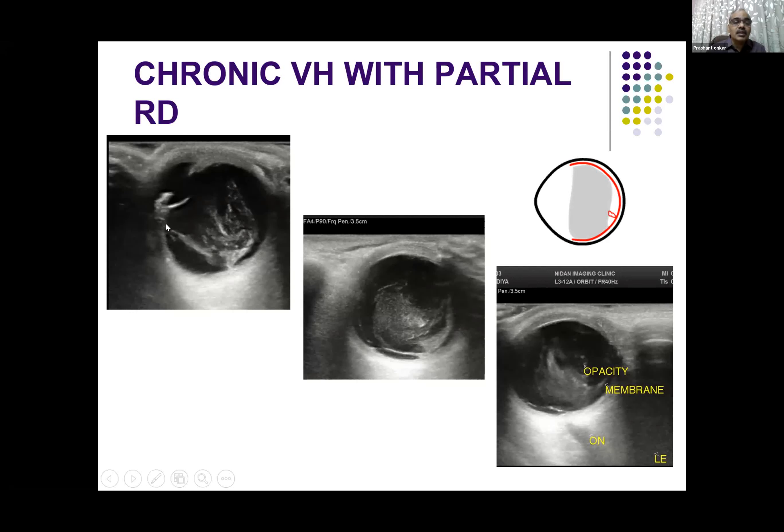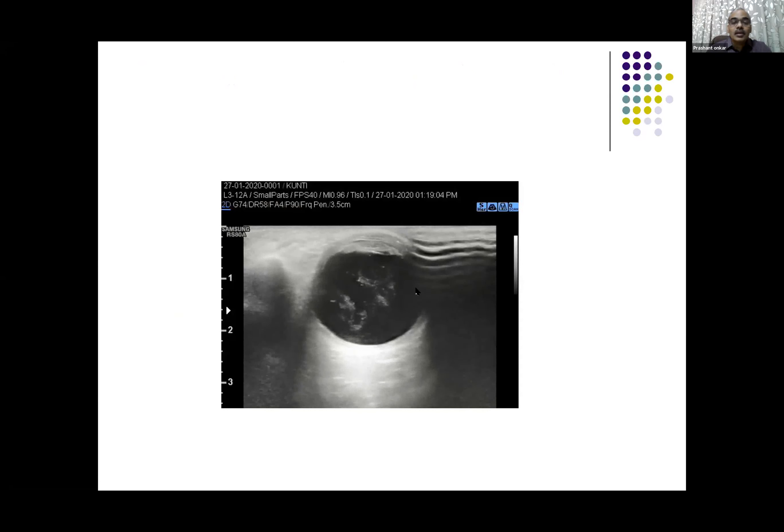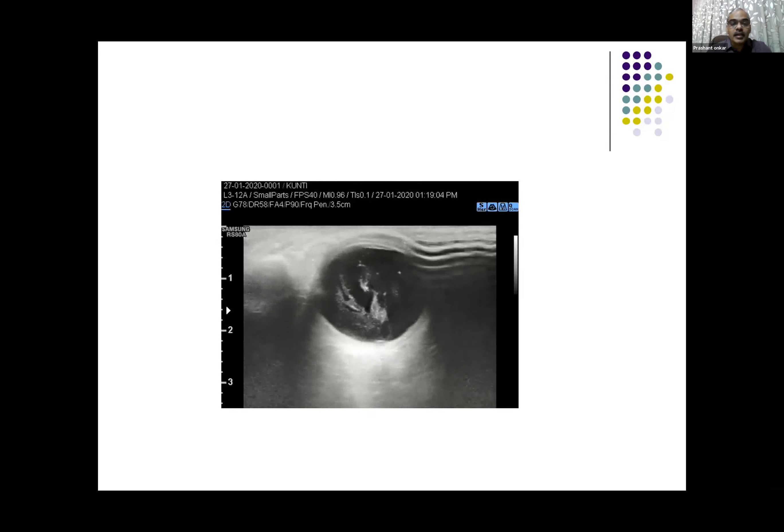In these B-scan pictures, there is an older vitreous hemorrhage and now due to the traction, one side of the retina is detached. In another example, there is chronic vitreous hemorrhage and you can see a very thin membrane posteriorly — there is minimal traction causing a milder detachment of the retina.